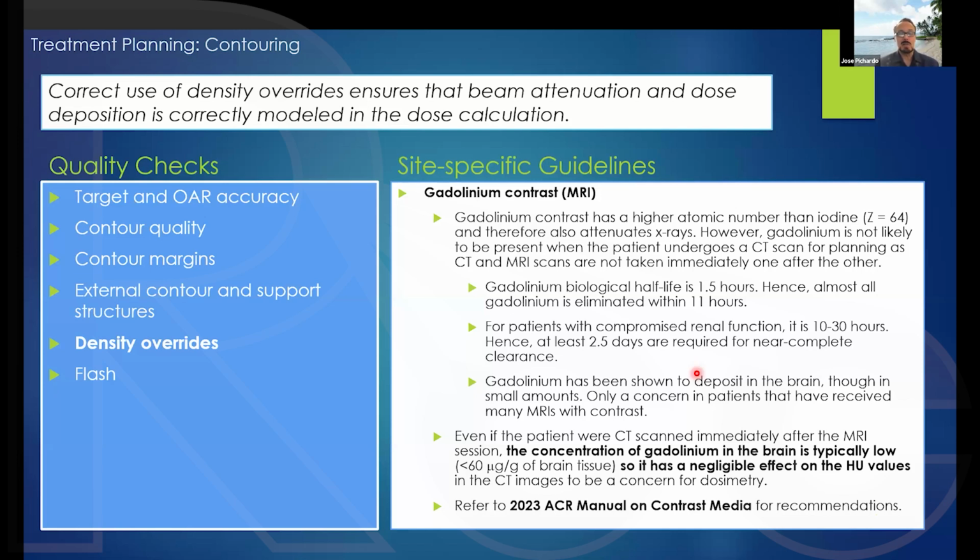And the thing too is, again, it's going to depend. Do you go through it? Do you not go through it? So it's going to be plan specific. But it's specifically designed to have a very low attenuation, so I cannot imagine that it would affect your plan significantly regardless. But you could always do a phantom test with and without and do a plan on it and just see what you get. I don't know if there's a paper on that. I haven't looked for it, so I'm not really sure if there is one.